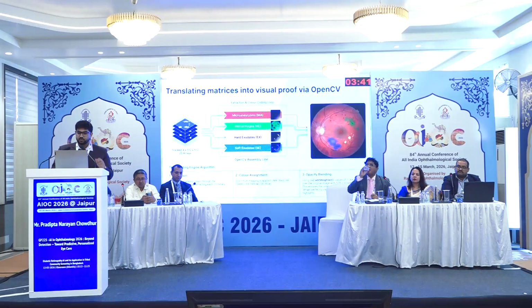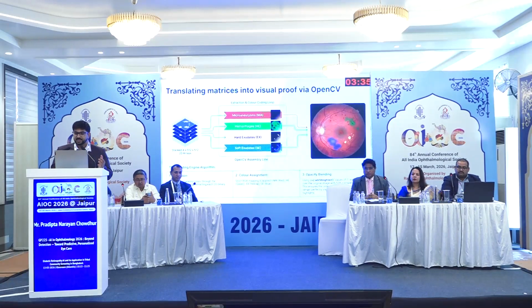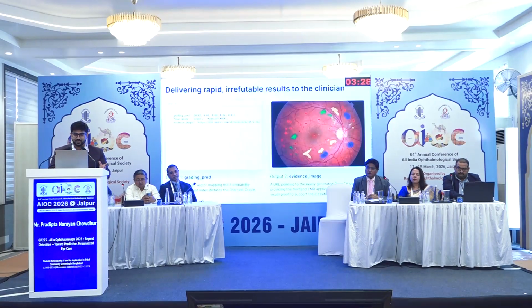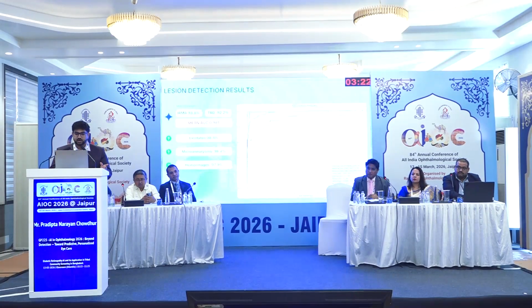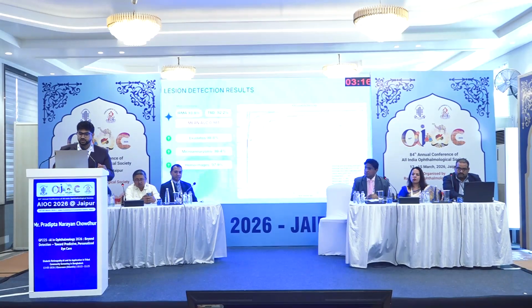We also used the lesion segmentation model where, as I showed you before, all the features were extracted and then used to help with the Grad-CAM explainability so that the doctor knows where the AI is coming from. And finally, we're very happy with our results. It showed high accuracy, and in lesion detection it was able to properly detect exudates, microaneurysms, and hemorrhages. So these were very good results on that end too.